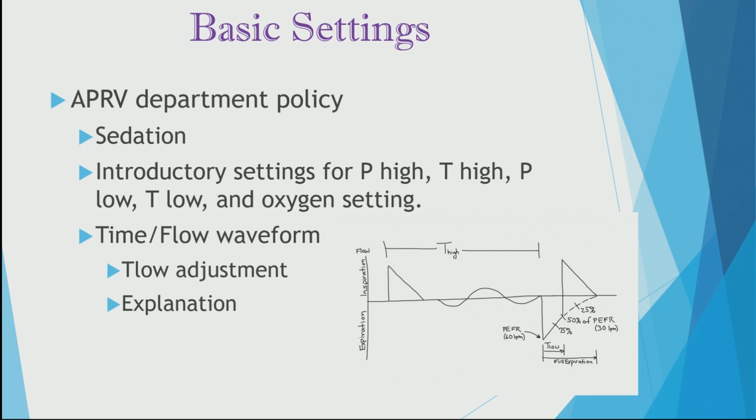First thing, let's talk about sedation. You can ventilate, yes, it is true, you can ventilate with APRV on a sedated patient, but it is in no way useful for that patient. Sedation must be turned off for the patient to benefit from this mode of ventilation. Remember, it allows for the patient to have unsupported spontaneous breathing. So there must be spontaneous respiration, spontaneous breaths.